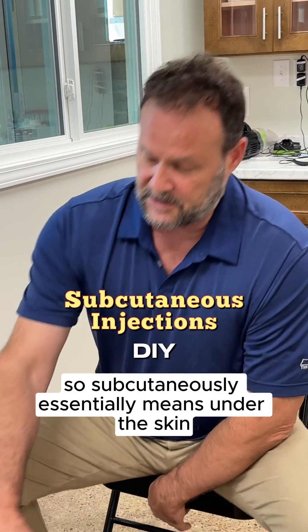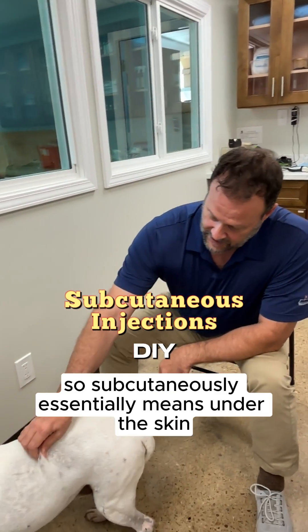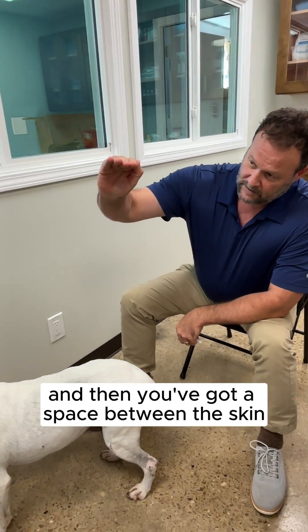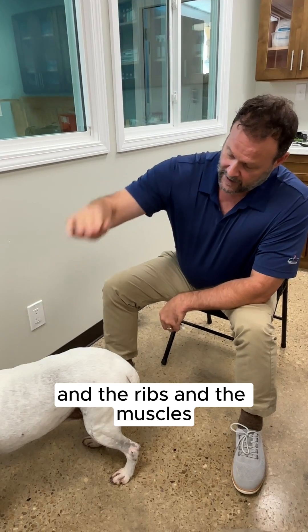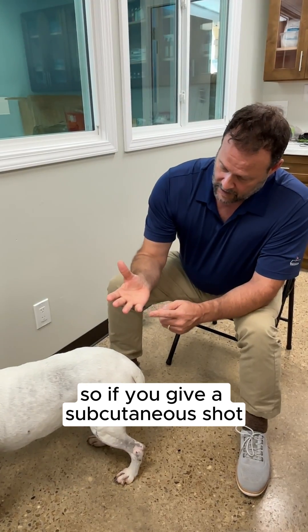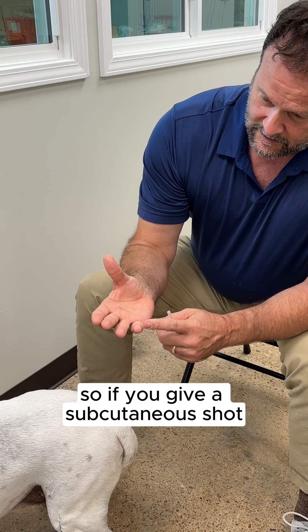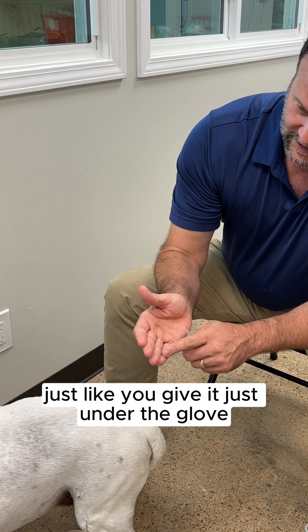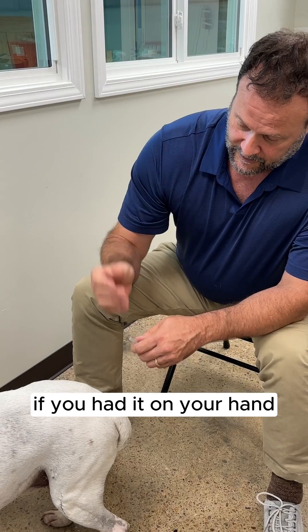Subcutaneously essentially means under the skin. You've got the hair, you've got the skin, and then you've got a space between the skin and the ribs and the muscles — just like having a glove on your hand. So if you give a subcutaneous shot, you give it just under the skin, just like you'd give it just under the glove if you had it on your hand.